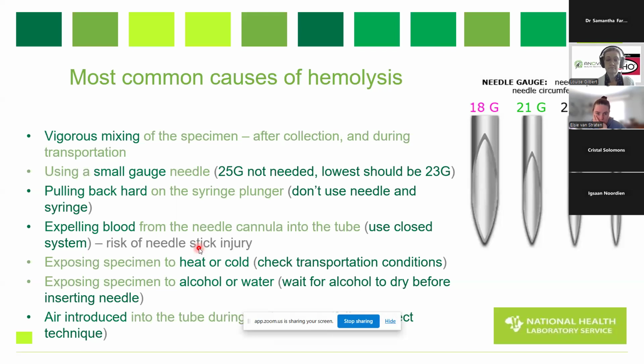And I had a nice picture of this for these medical students about how to prevent needle stick injuries. So I'll just give you a little tip. Take your tubes and put them flat on the table, and then guide your needle into the rubber stopper, rather than holding the tube in your hand and guiding the needle to the rubber stopper. If that needle slips, you've got yourself a needle stick injury, and it's something that's so easily avoidable.